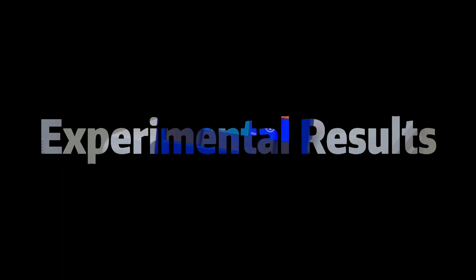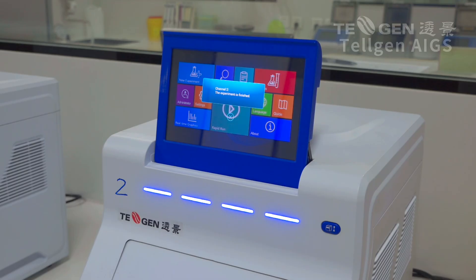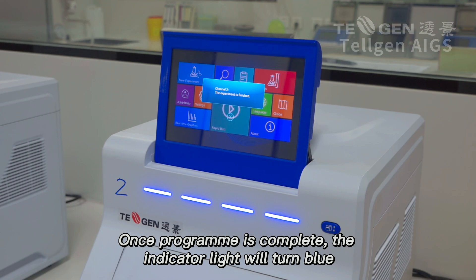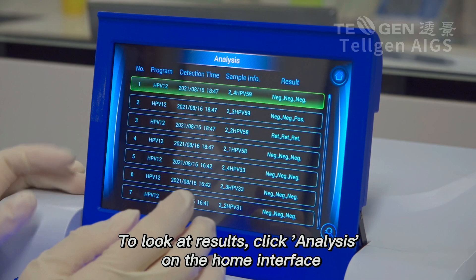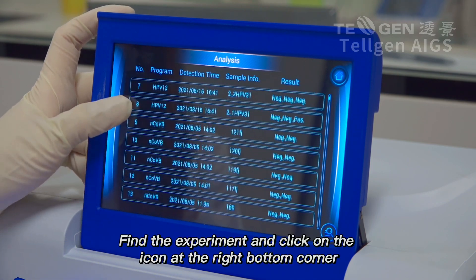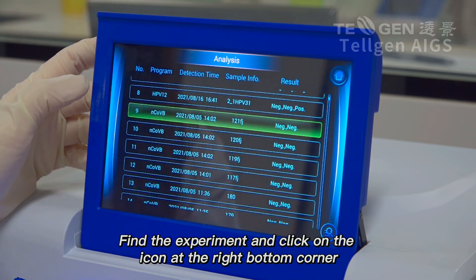Experimental Results. Once the program is complete, the indicator light will turn blue. To look at results, click Analysis on the home interface. Find the experiment and click on the icon on the right bottom corner.